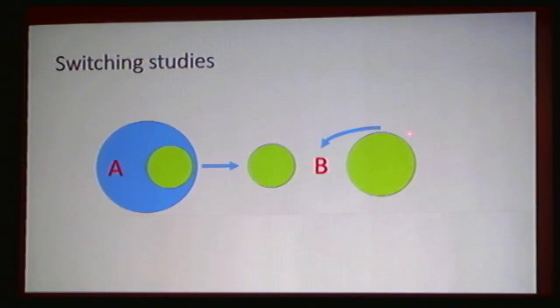So here you can see that we most likely would be thinking that B was the big change, but actually the patient received a number of injections up to here and a higher number of injections up to here. So if there are any late responders, they will pick up vision and keep dropping the thickness of the OCT. And it will not be because of the change, but because they receive further injections.